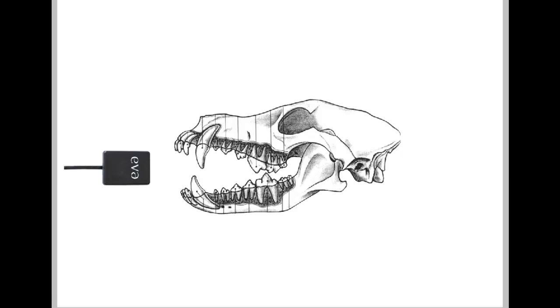And then again, going for the maxillary, we would face it in portrait with the image side up if we were going through the upper teeth, or the image side facing down, as you see here, for going for the lower incisors, which would be here, or for the lower canine.